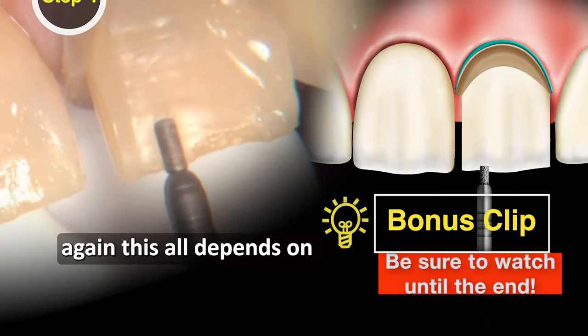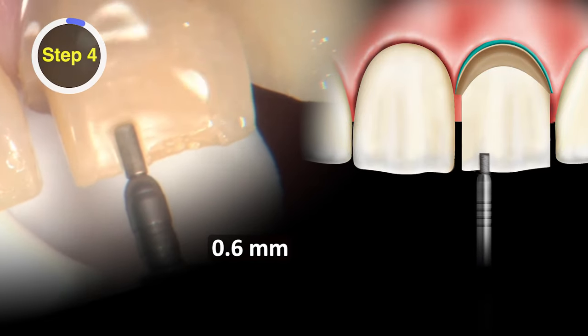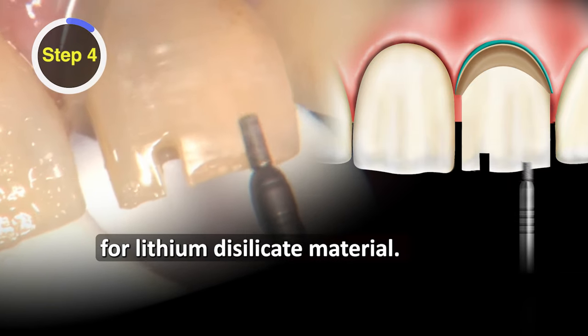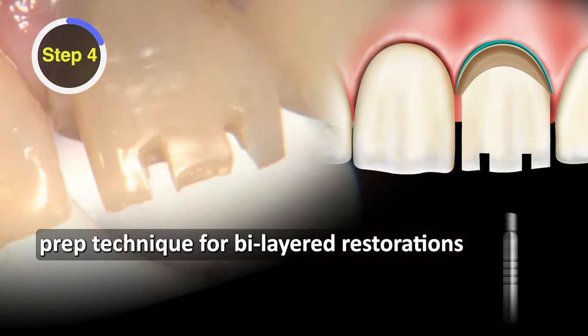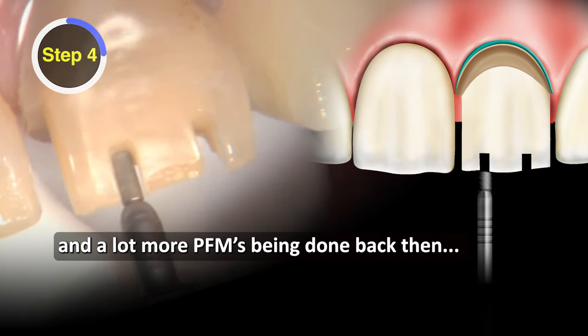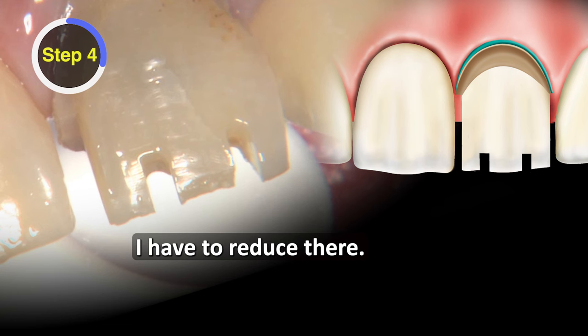This is the incisal edge reduction. This all depends on what material you are using. You could go as conservative as 6 tenths of a millimeter for a zirconia material up here, or one millimeter for lithium disilicate. We're actually doing two millimeters because this was a standard prep technique for bi-layered restorations back in the day when we were doing a lot more PFMs. So those depth cuts are done, and now I know how much I have to reduce there.